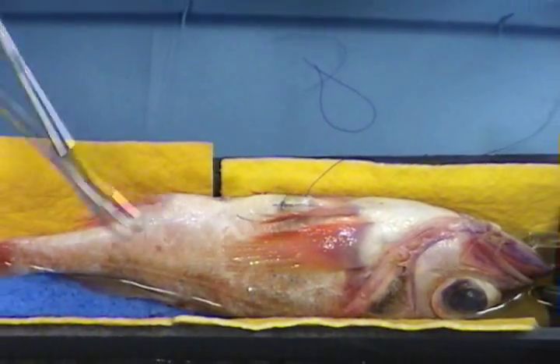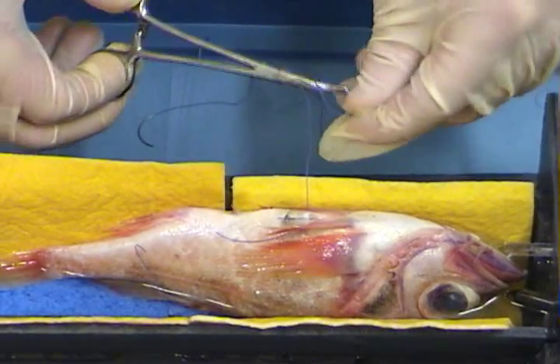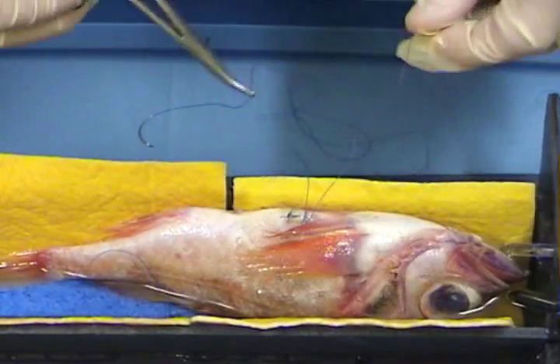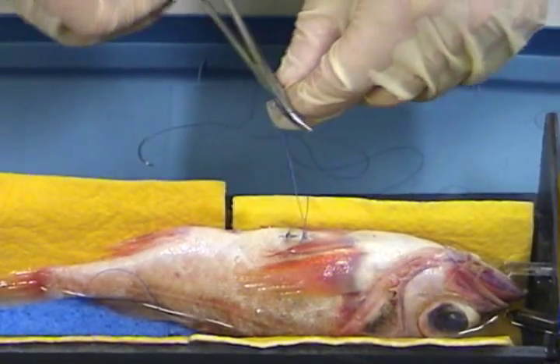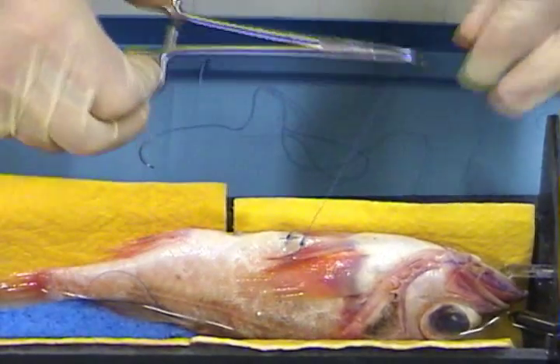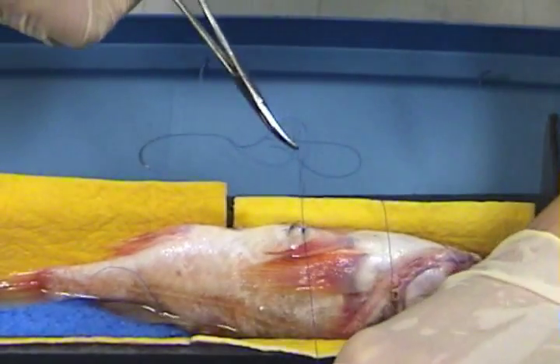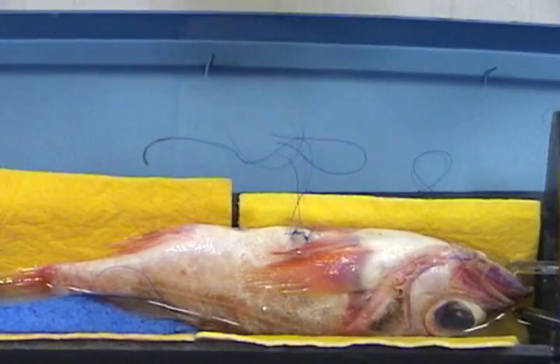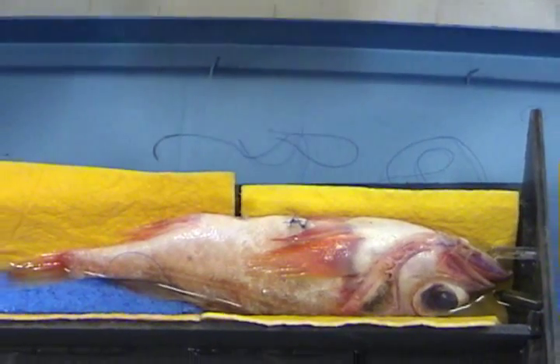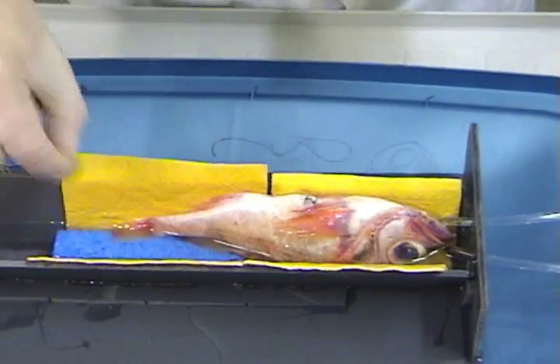Finally, I should mention that you should consult with qualified researchers and vets that have considerable experience, and the surgical procedures to surgically implant the tag into the fish must be approved by your regulating body that oversees animal care standards. Also, you must make sure that all surgical instruments and materials have been sterilized. Now you are done. Your patient is ready to recover in the holding bath — transfer the fish over and allow it to recover for the time you think is required for full recovery before release.